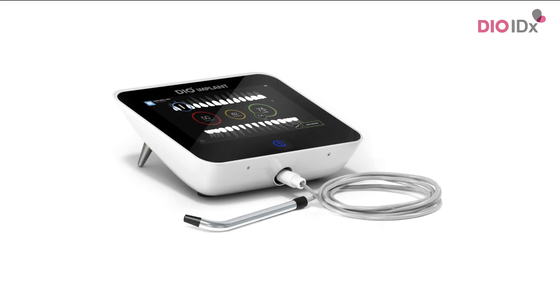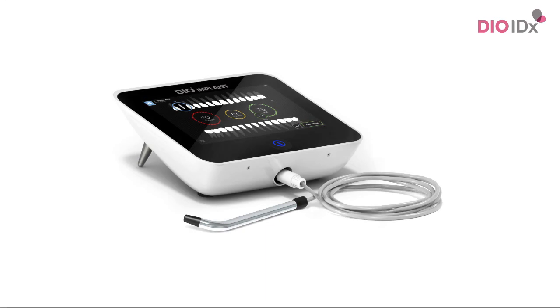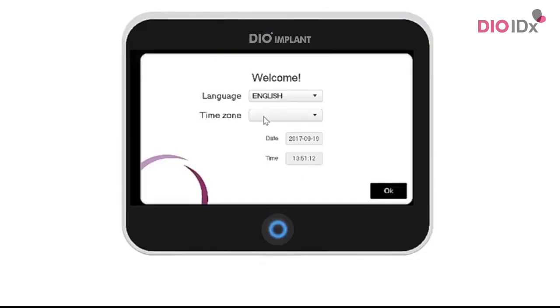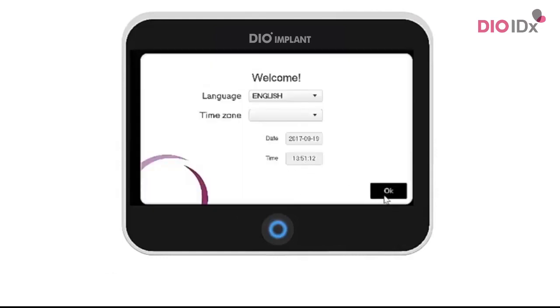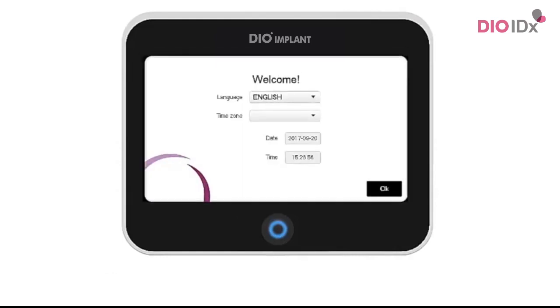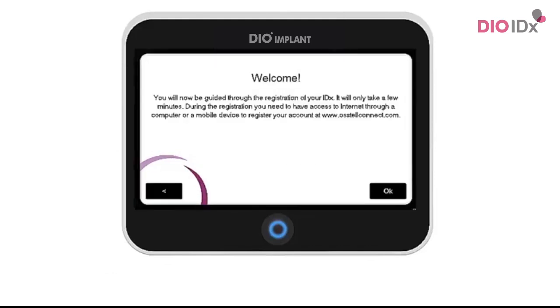using Osstel IDX. Before you get started, you will need to set up and register your instrument. When you first turn on your IDX, you will be prompted to select language, time zone, date, and time. You will now be guided through the registration of your IDX. It will take only a few minutes.